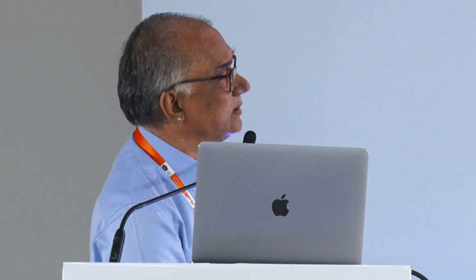See, this is the diagrammatic representation. I am really jealous of my postgraduate. He does an excellent job. Then you do an ICG and then see the aneurysm. Now we have decided to put a fenestrated clip with the side because it is going behind that. You cannot turn the artery. So now with the ICG, you can see that the aneurysm is excluded and the flow is good. So now you have seen the internal carotid artery aneurysms, this is how we have approached them.